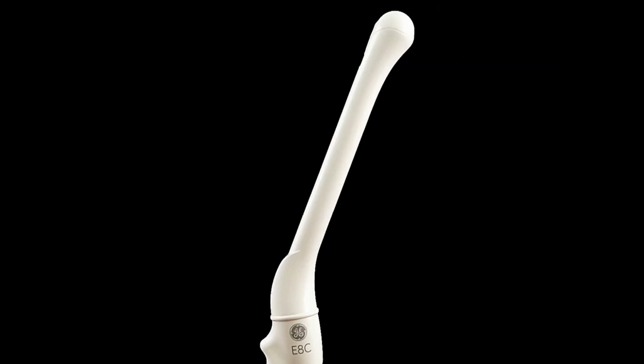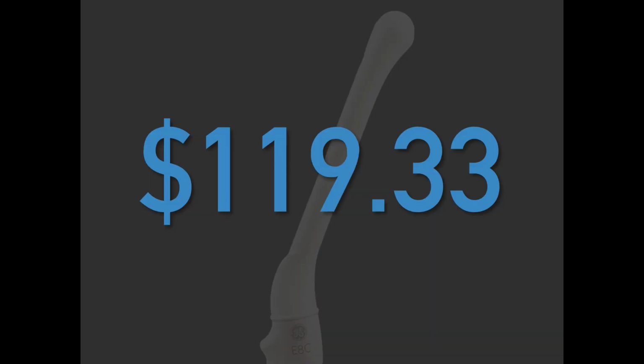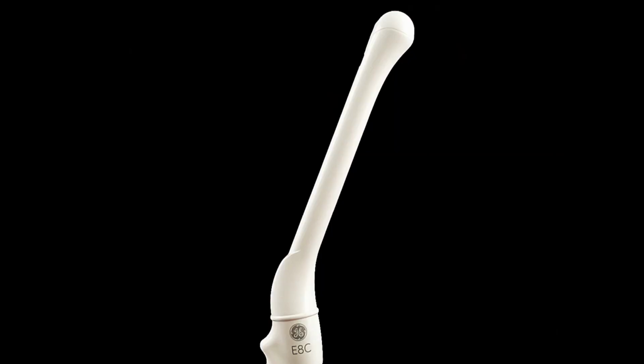So what about ultrasound, right? Ultrasound is something that we can do at the bedside. It can potentially give us that same kind of anatomic information up front, but you and I control it. It's a little bit faster maybe. It's a little cheaper. If you're billing, depending on what CPT code you want to bill, it's close to $100 cheaper, 90-ish bucks cheaper. It's $119.33 for an ultrasound soft tissue neck, and that includes both the hospital fee and the professional fee, in 2021 Medicare dollars.